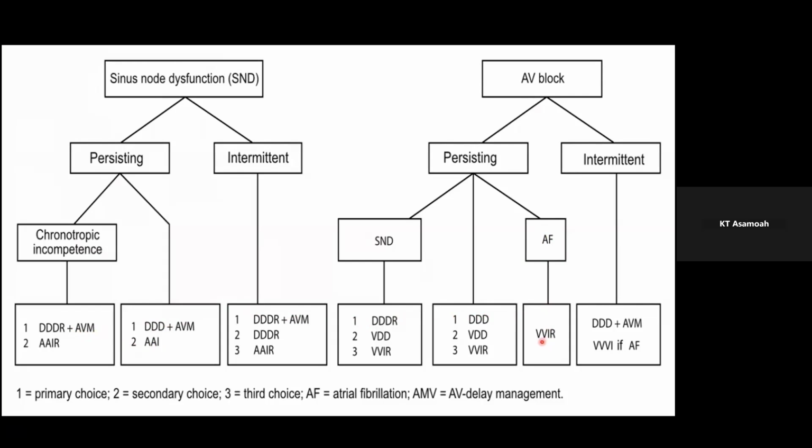Because if you have a lead in the atrium, which is now in AFib, driving at a rate of 300 to 600 times in a minute, it's going to cause a lot of confusion for the pacemaker and will be ineffective. And in the end, the patient will suffer. So for AFib, your aim is to pace the ventricle while ignoring atrial activity.